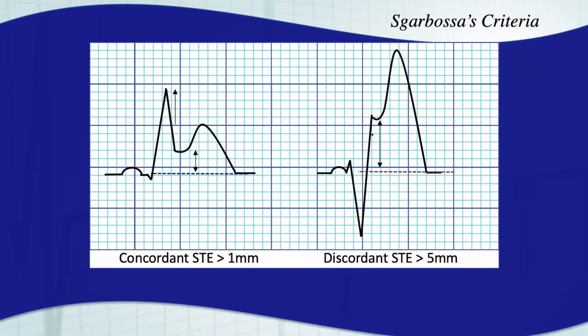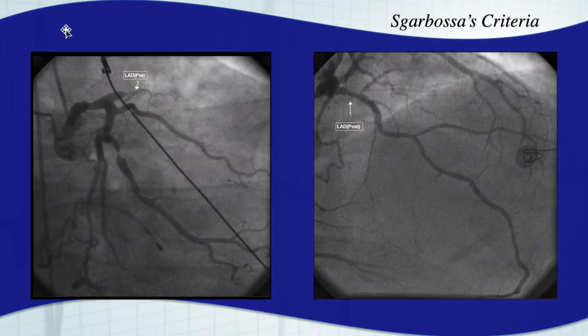All right, now this patient was experiencing an MI. I'm going to go ahead and fast forward to the angiogram here. So here's the pre, this is where they were before getting reperfusion therapy. You could see that the LAD kind of stops perfusing right about there. There's no blood flow to this extended part. And then after they reperfused, they had great blood flow and a lot of tissue was saved. So let's go back to the 12 lead.